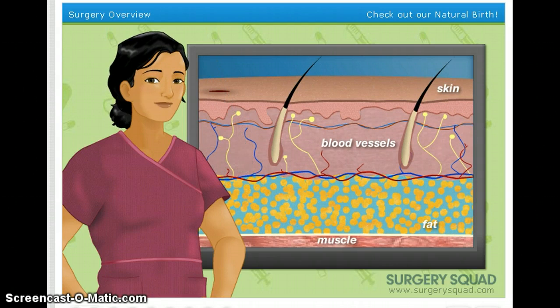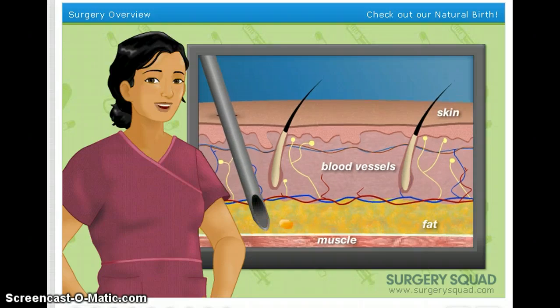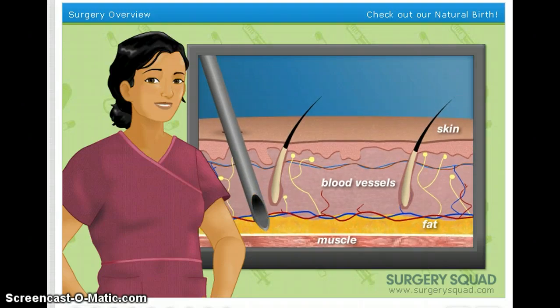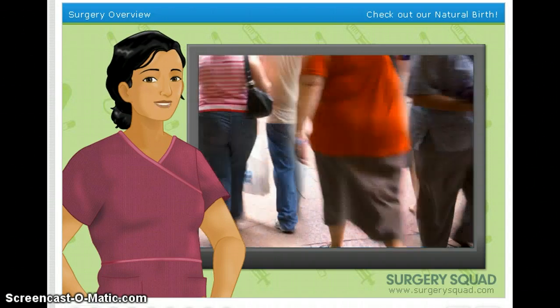After injecting the fluid, we'll be using a hollow metal tube called a cannula to break up and essentially vacuum fat deposits out of the body. Before we begin, remember that liposuction is not an alternative to diet and exercise. And, unfortunately, not everyone is a good candidate for liposuction.